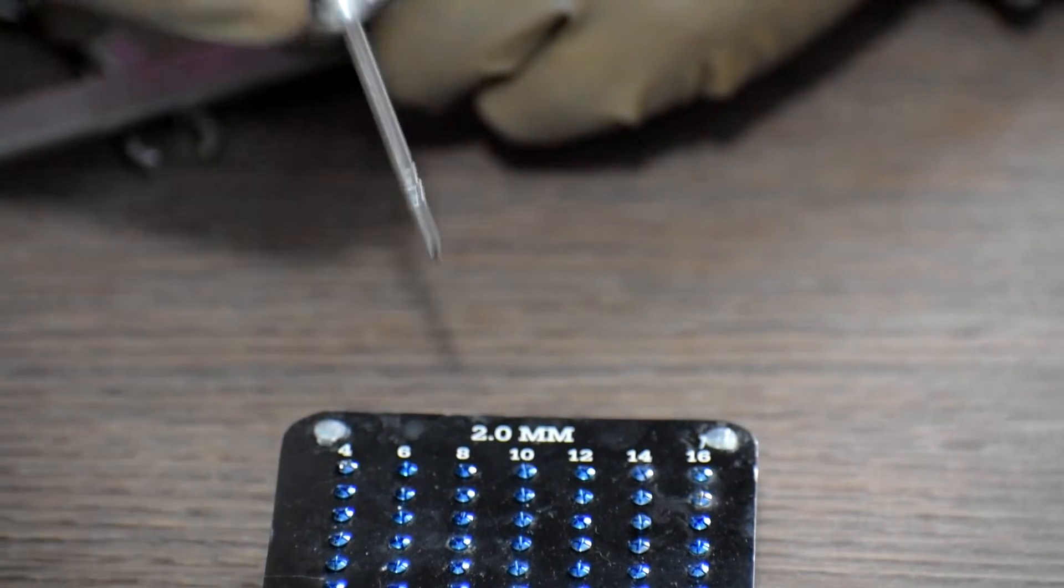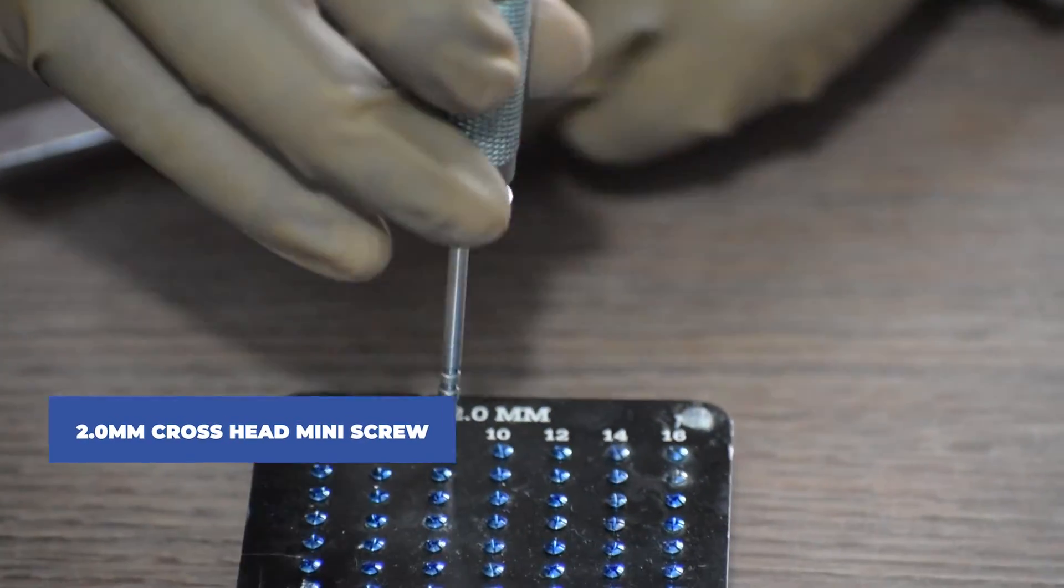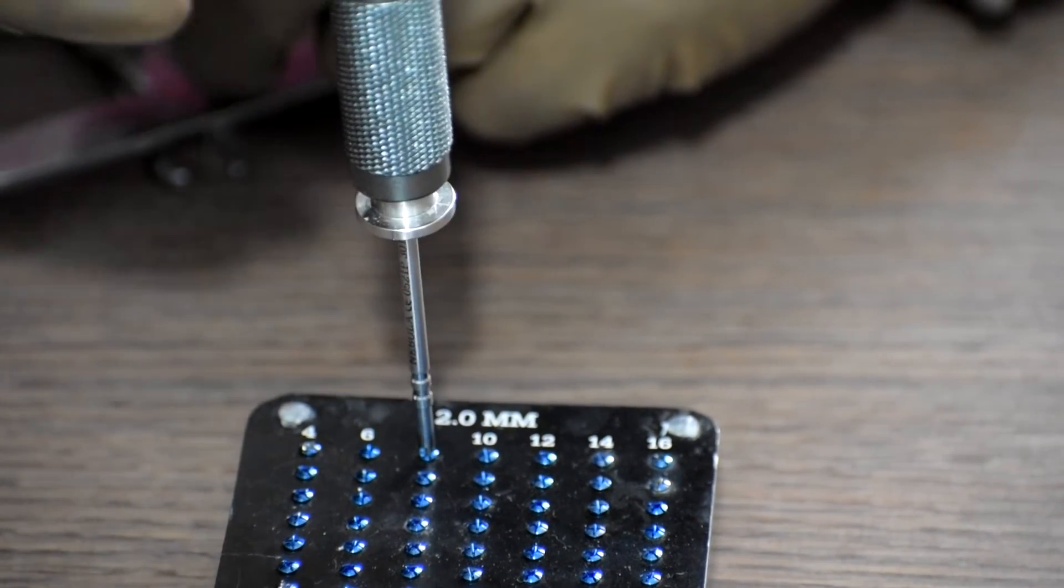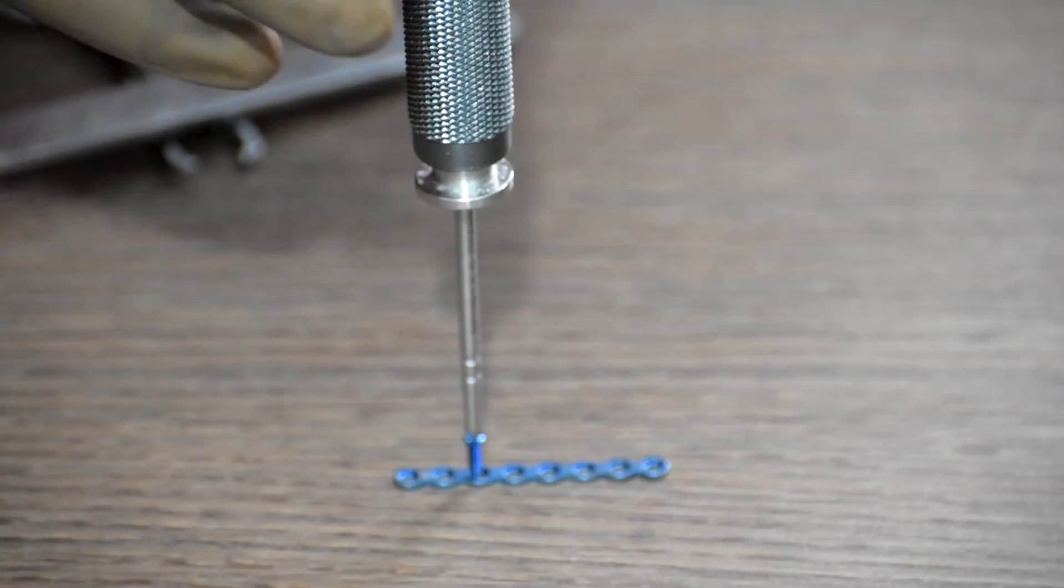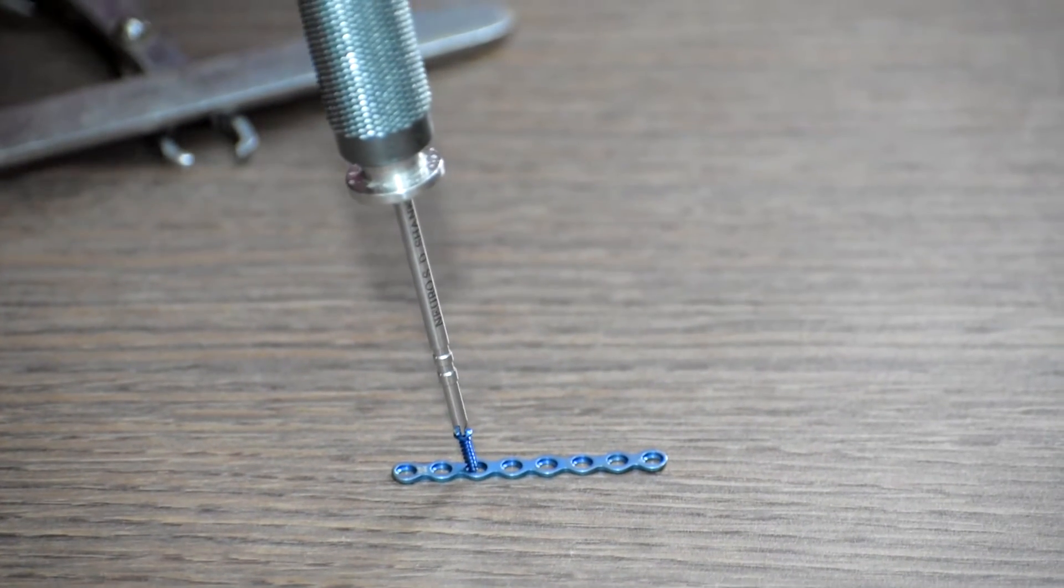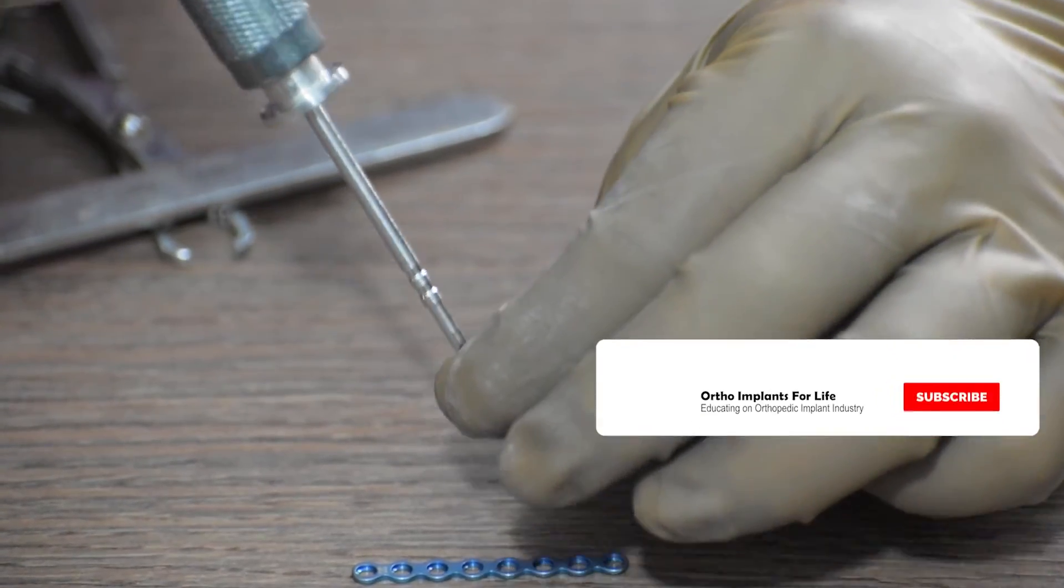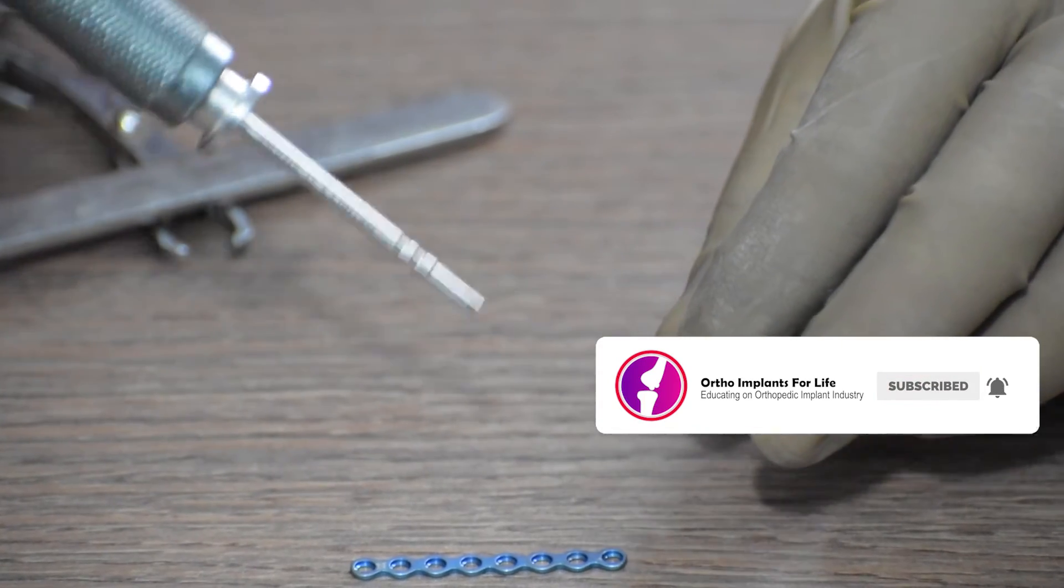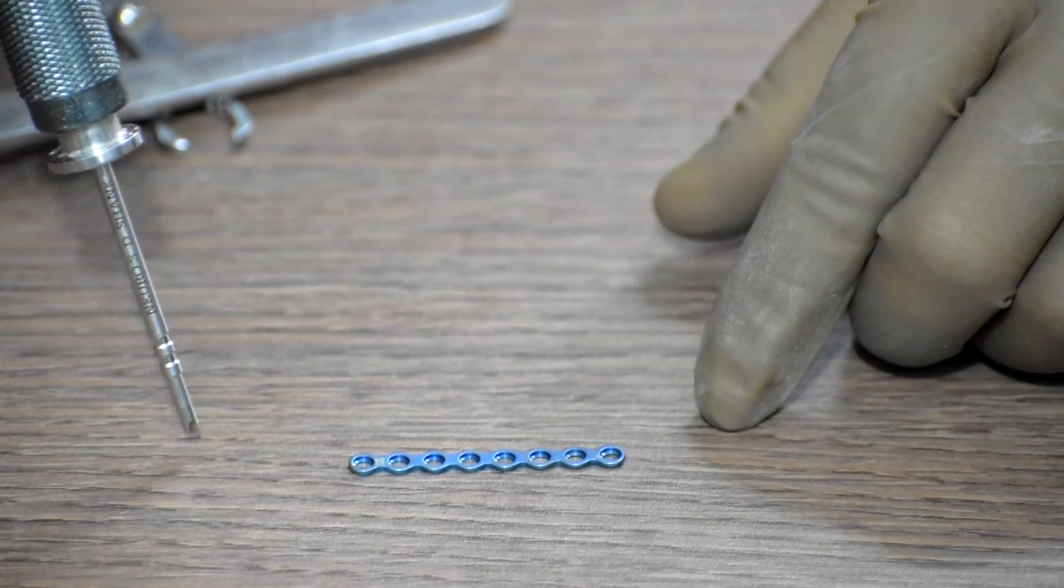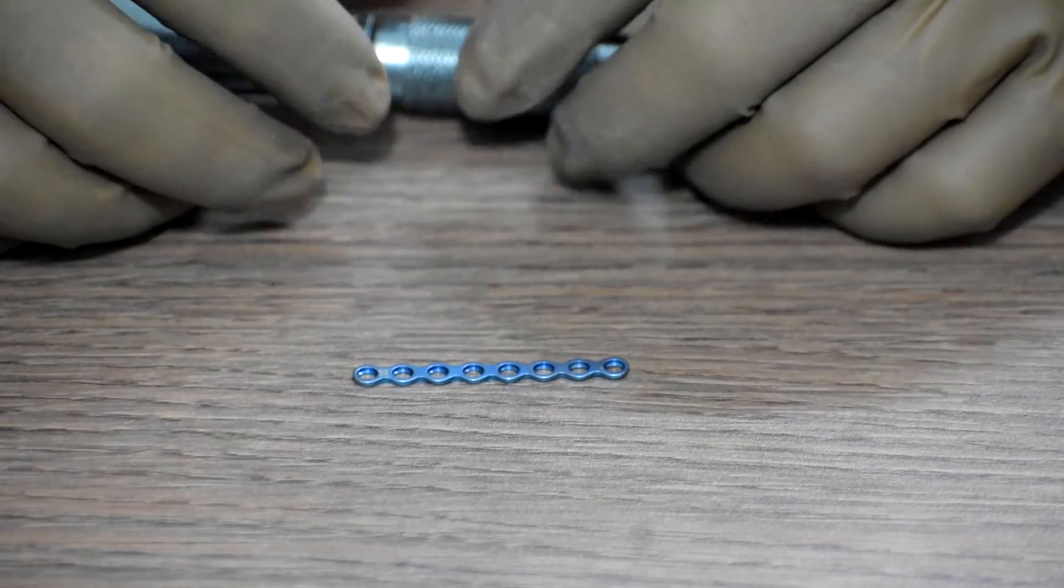We take the screwdriver and then take a 2mm cross-headed mini screw of the desired length. Pick up the screw with the screwdriver so that the screw gets locked in the screwdriver. As these are mini screws, it is hard to handle if it is not already locked in the screwdriver. Thereafter, we take the screw and fix it in the mini plate. We then remove the screw from the screwdriver; the screw stays back in the plate. We can fix other screws as well, as per surgeon's preference and demand, with the same procedure.